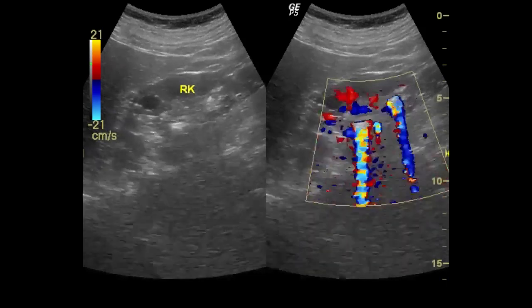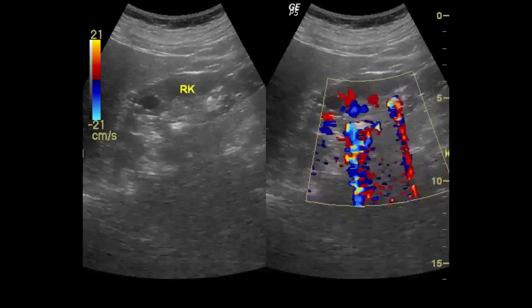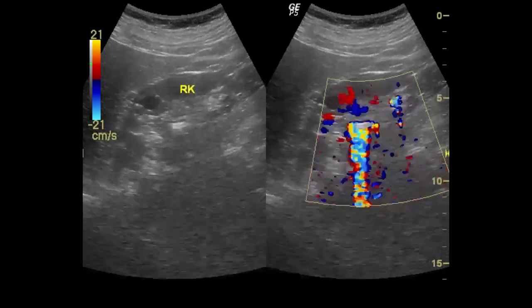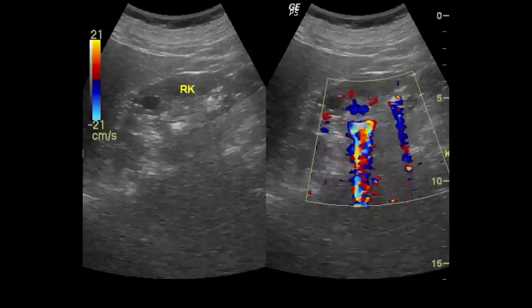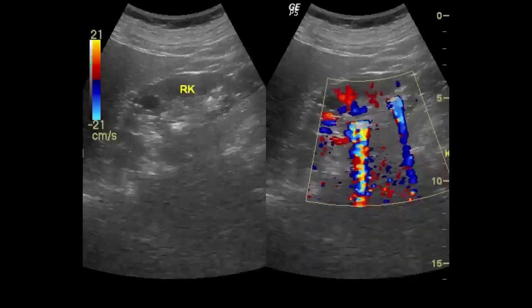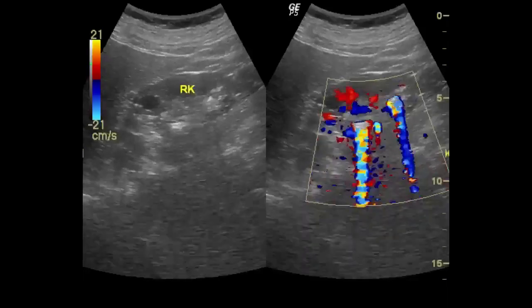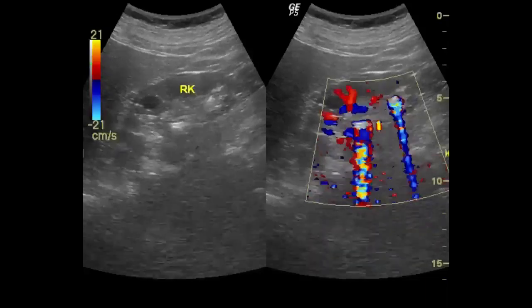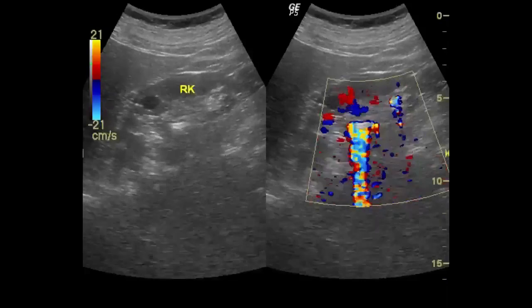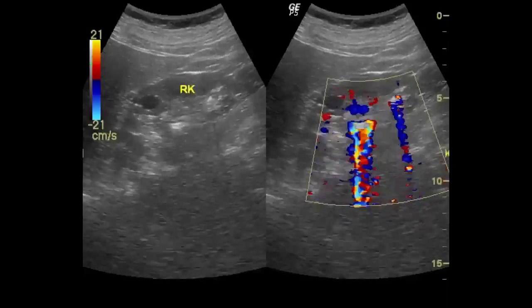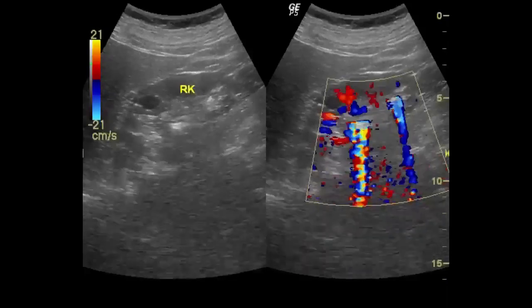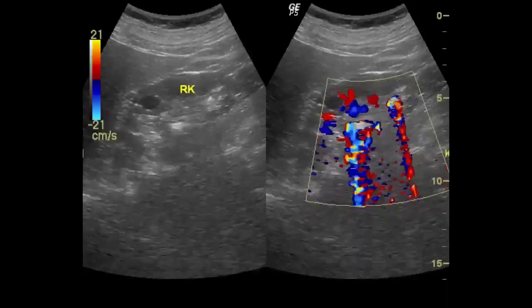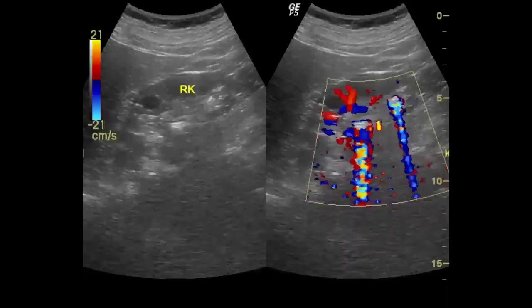Reliable detection of urinary stones on ultrasound is related to stones with both distinct echogenicity and posterior acoustic shadowing. However, in many cases, it is difficult to determine whether a urinary stone is present because of its indistinct echogenicity and indiscrete posterior acoustic shadowing.